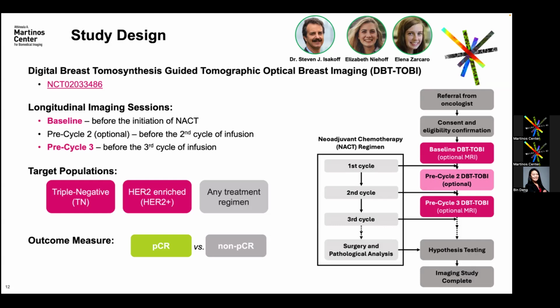So in optical imaging, the fundamental image contrast is hemoglobin-based contrast, but solid tumors take the compression differently than the surrounding tissue, and this mechanical response difference results in different blood distribution between the lesion and the background. So ultimately we're measuring hemoglobin, but that is driven by the mechanical response of the breast tissue to the compression.